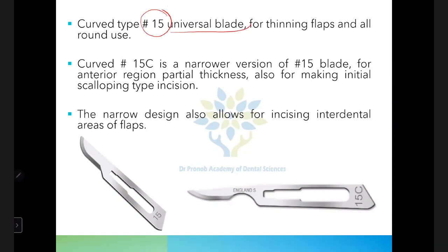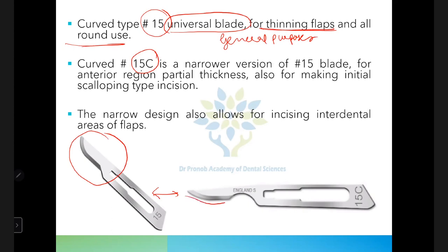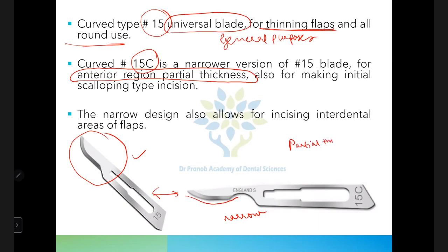Blade 15 is called the universal blade — used for all general purposes including thinning flaps and all-round incisions. Blade 15C is a narrower curved version of the 15, used in the anterior region for partial thickness flaps.